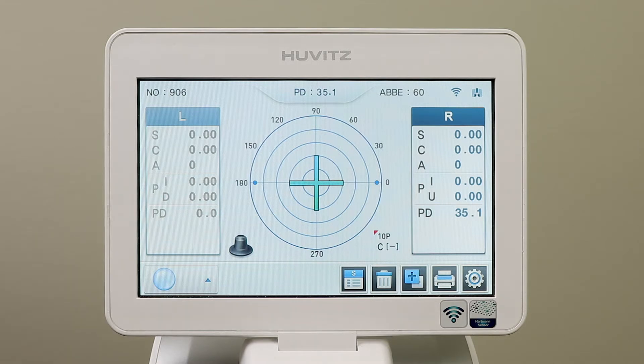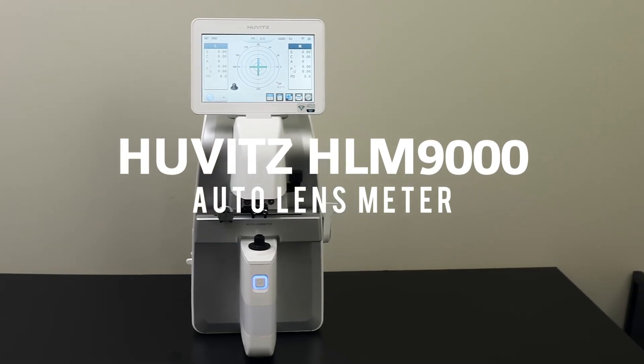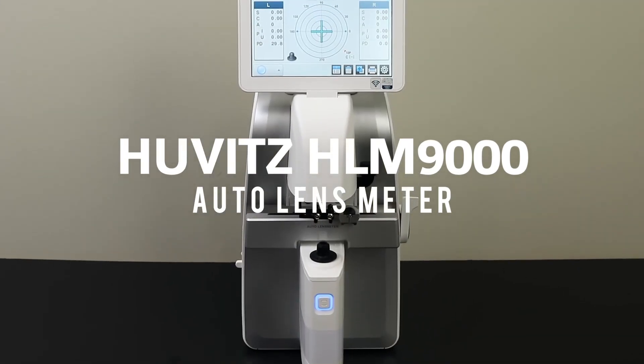In the top right-hand corner, you will see the refractor icon and the Wi-Fi icon. This tells you that the system is connected and working. The HLM9000 — one of the many great products from Norwood Device and Diagnostics.